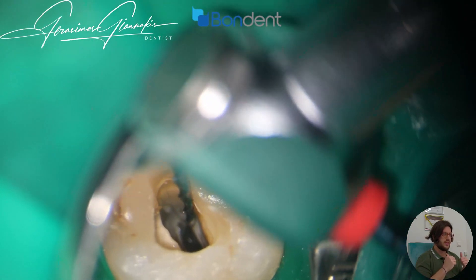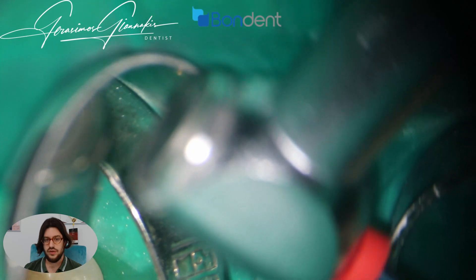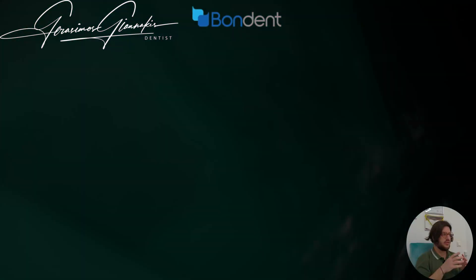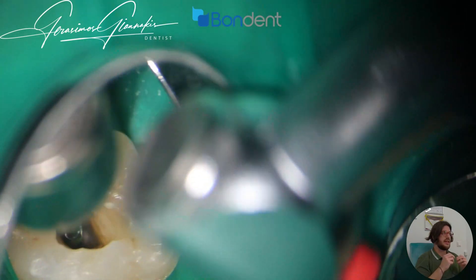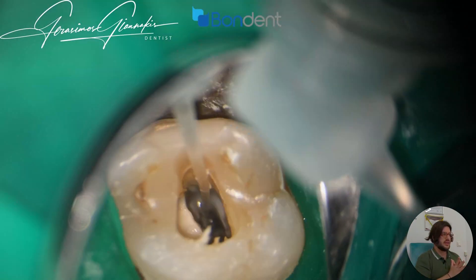First of all, I need to evaluate the radiograph and understand that I have two canals. Having this knowledge, I can insert a pre-curved file to cut the orifice and enlarge it a little bit so that I can easily access it with the next instruments.